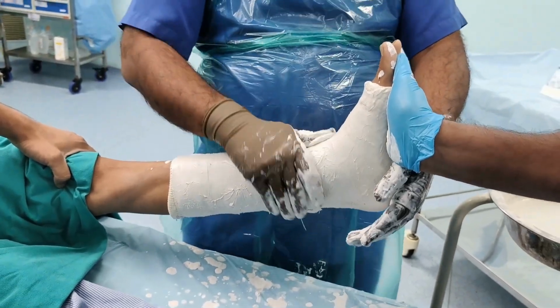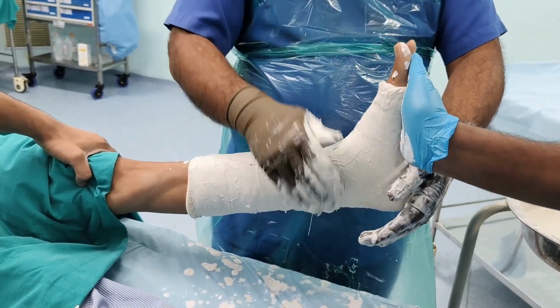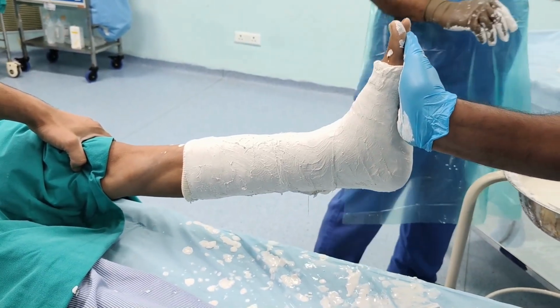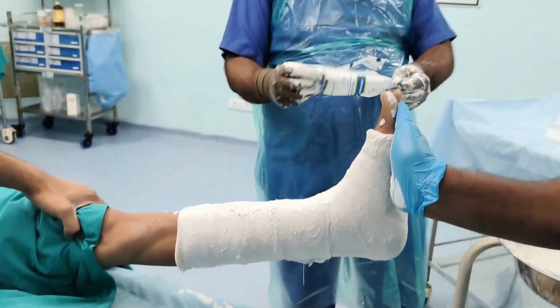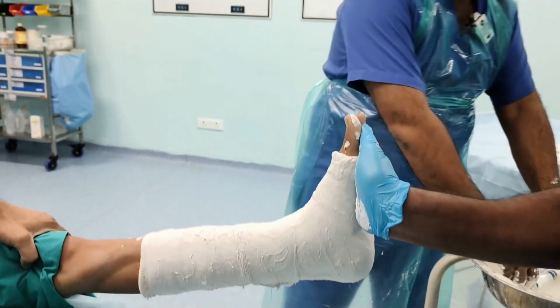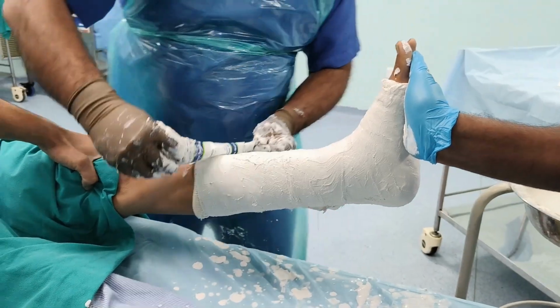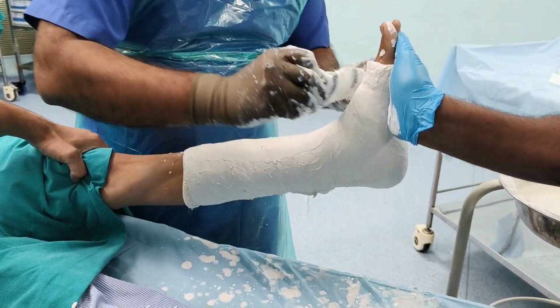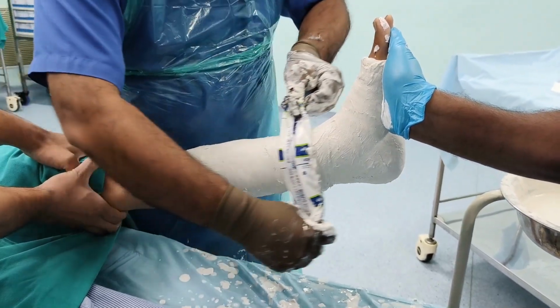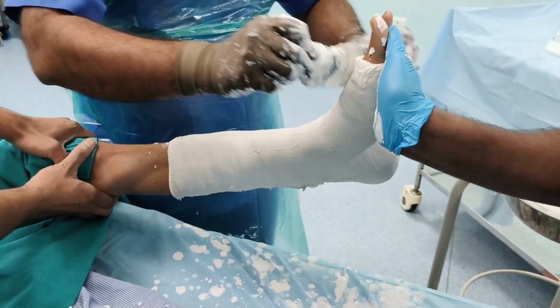So once you have achieved the desired strength of the plaster, you can either take this cover of the POP bandage, or you can take the gloves also and soak it in water, and yes, you can just smoothen out the plaster so that it looks good. So this is how it will become more shiny, more attractive.